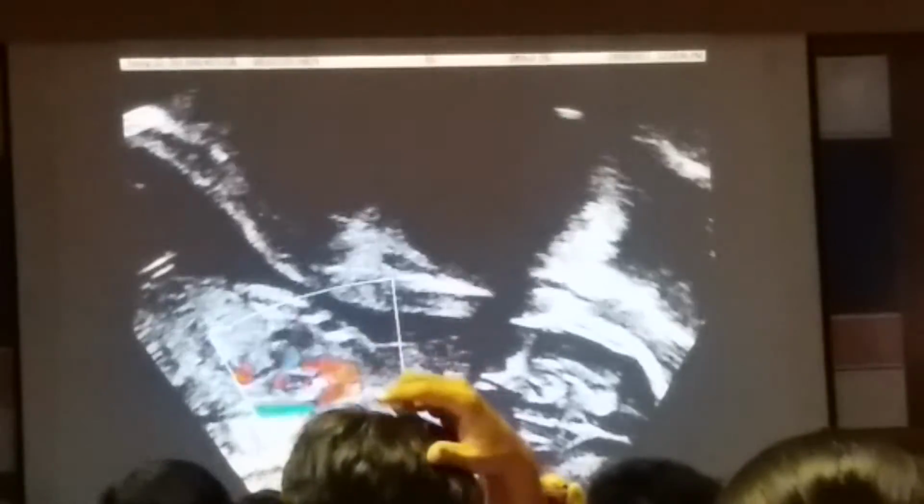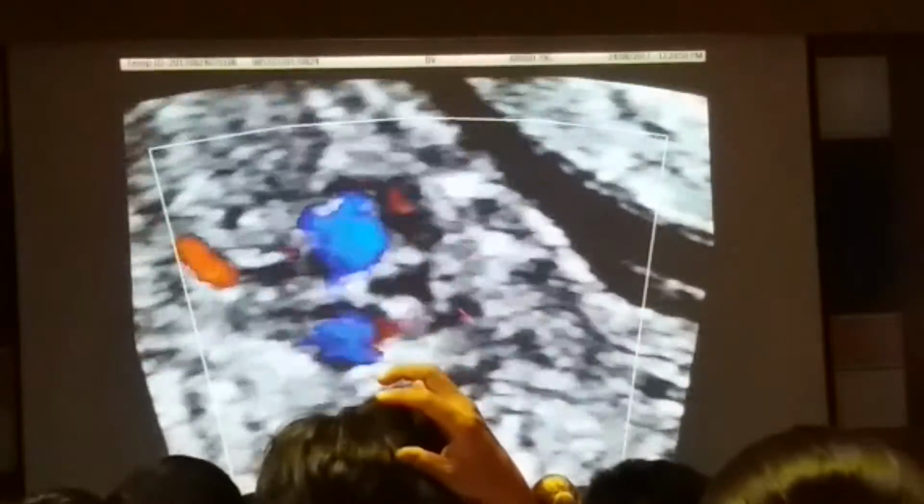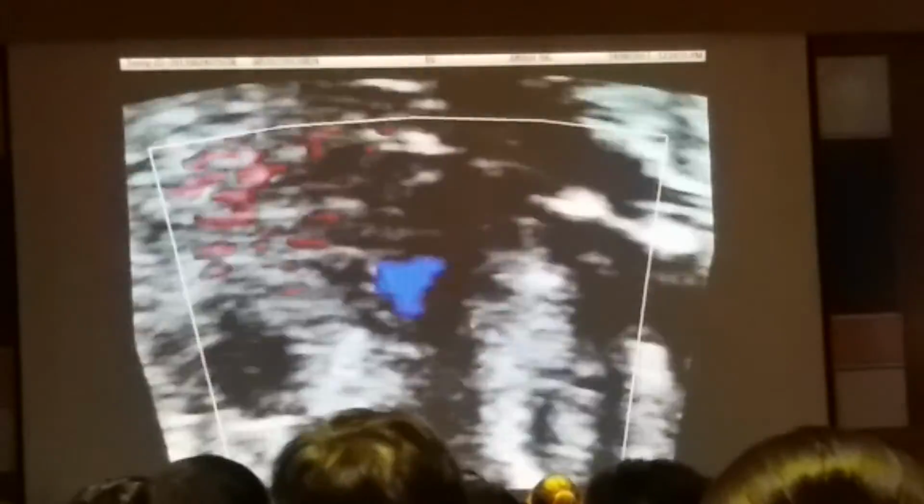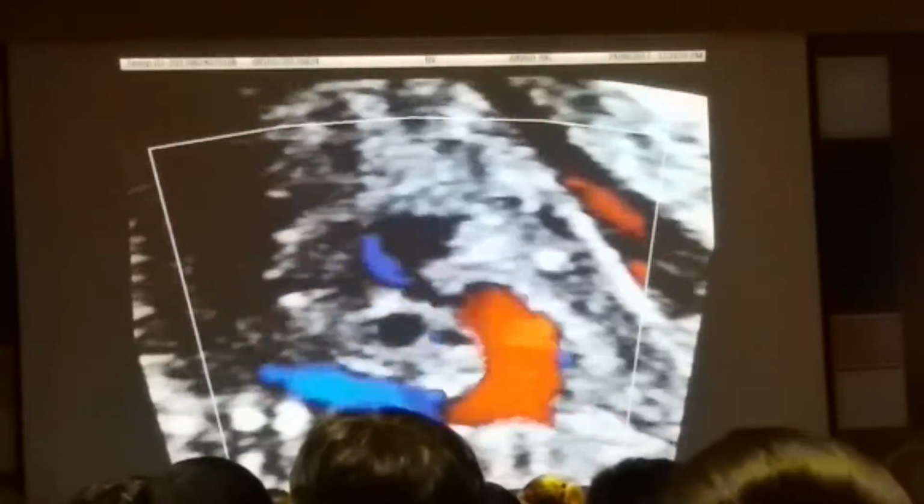All right, now let's zoom the image. Okay. So there's the aortic arch, eh? Beautiful. Great, okay. All right, always say that to the mother, huh? Okay, we sort it down here, hey?